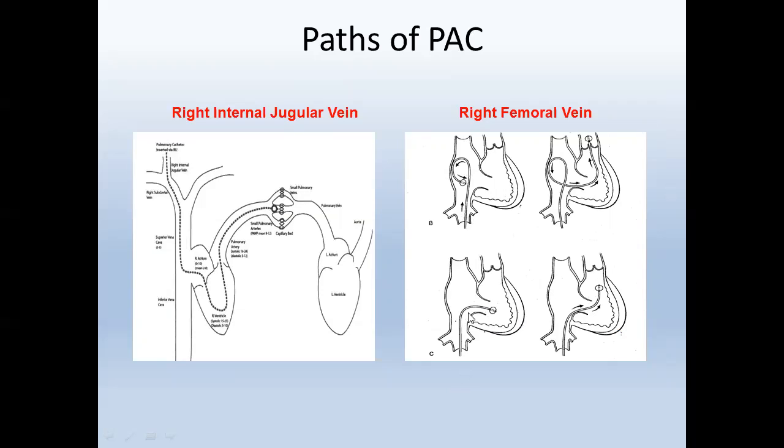What people do is, when they go from the right atrium to the right ventricle, they go deep into the right ventricular apex and they're just trying to push. It's just getting PVCs, it's just going nowhere. So the key is just to cross the tricuspid valve, stay there, wait for the blood flow, keep a back and forth movement, and when the balloon pops up, just push with the tip. I think that's the easy method.